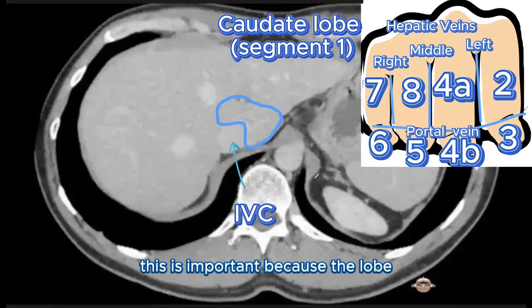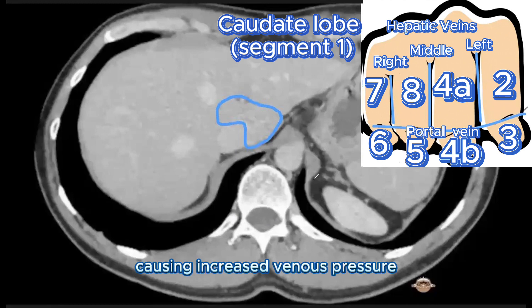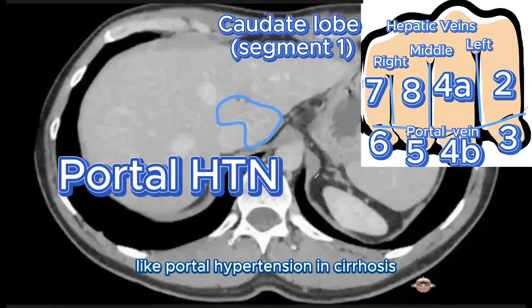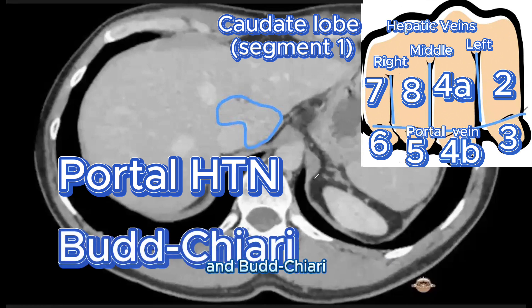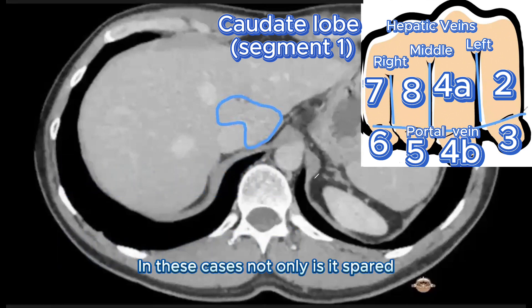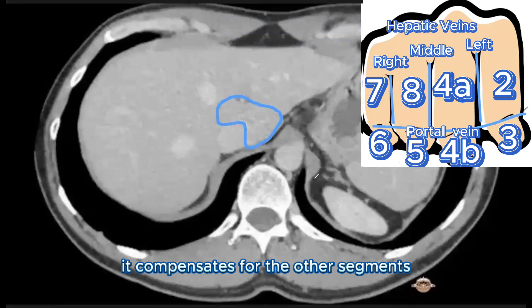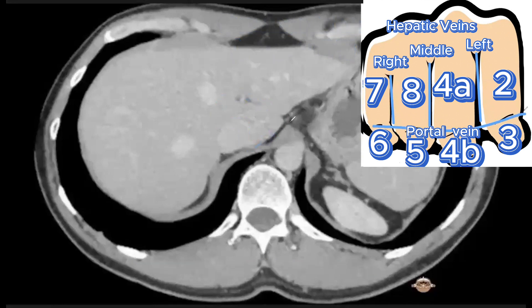This is important because the lobe tends to be spared in diseases causing increased venous pressure, like portal hypertension, cirrhosis, or Budd-Chiari syndrome. In these cases, not only is it spared, it compensates for the other segments by growing in size. Now we locate segment 2.